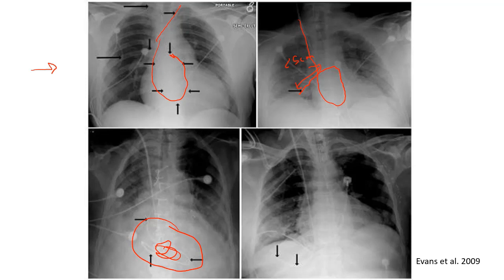So always keep an eye on where you are distance-wise. If you're 50 centimeters in and you haven't seen a PA pressure tracing, think seriously about deflating that balloon, retracting the catheter, and starting over, because it's likely that you're just looping around in that RV.